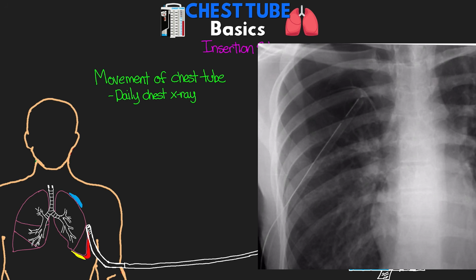And the big thing that we're looking for is that the fenestrations or the holes that are at the end of the chest tube, which help to facilitate that drainage, that they're still in the pleural space within the chest wall. And so here's an example of that on x-ray, just to kind of show you. It's pretty easy to see here along the chest tube, there's actually a radio-opaque line that shows up, and then there's a gap that you'll see up here towards the end, and that's to mark where the fenestration begins.